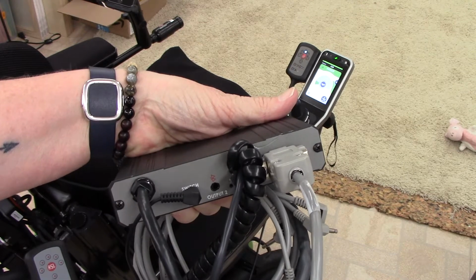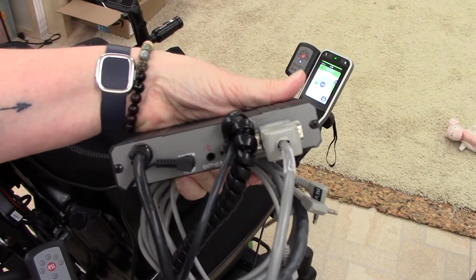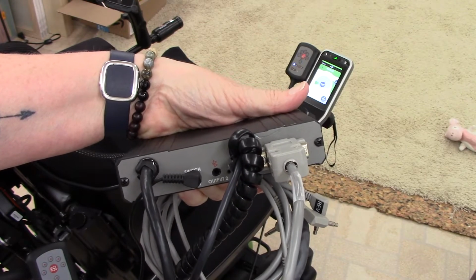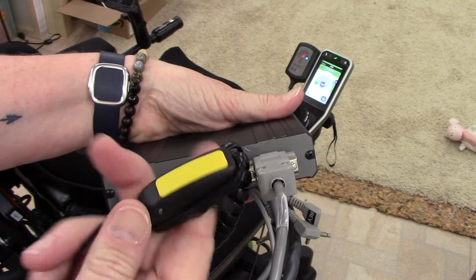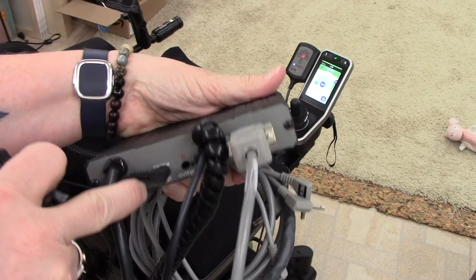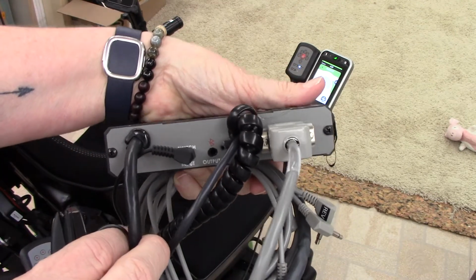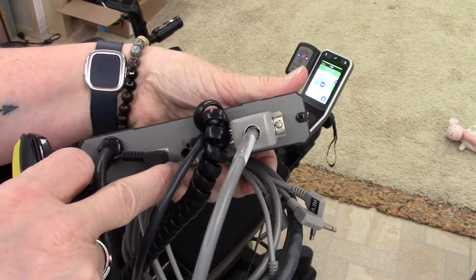Okay, here's the back of the single switch scanner, and I just want to show you what's plugged in where so you have some orientation to where things go. Here's the switch I'm going to use, and it's plugged into this first switch port that says switch input right here. Okay, nothing in that output, right?